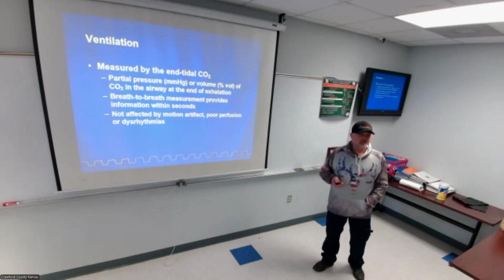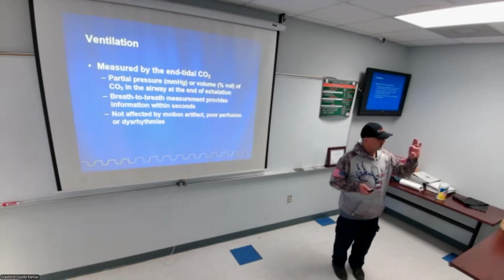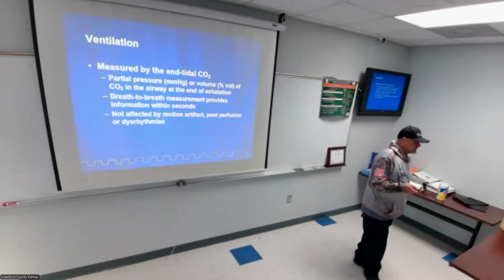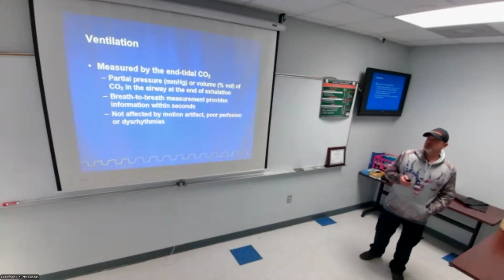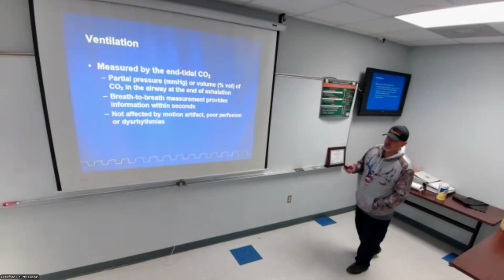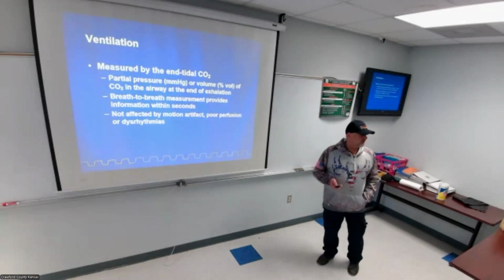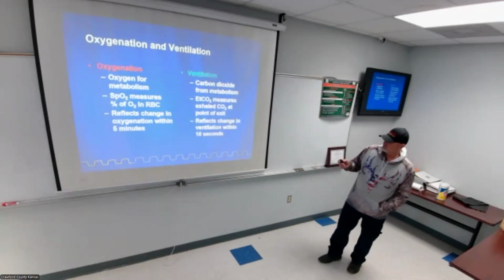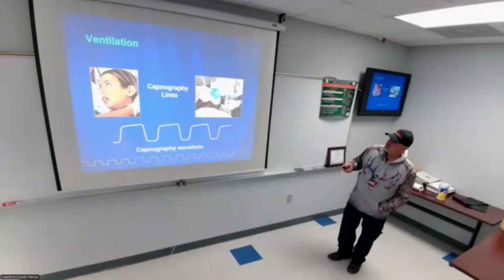I've even tried putting them on and putting a mask over them, leaving the hole out of the mask so you have a good exhalation vent. It doesn't even work. The only one I think you can count on 100% is going to be the end-tidal of your ET tube. That's just capnography lines.